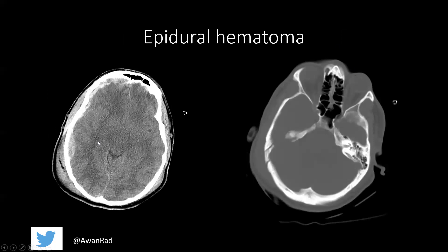An epidural hematoma — this is a non-contrast CT image of the head. All hemorrhage is going to be bright on a non-contrast CT examination. Here is the epidural hematoma: notice that it's along the convexity, along the periphery of the brain. It has a convex border, kind of like a lens-shaped border. It is highly associated with skull fracture, and they may show you an image in bone windows showing the break in the calvarium.